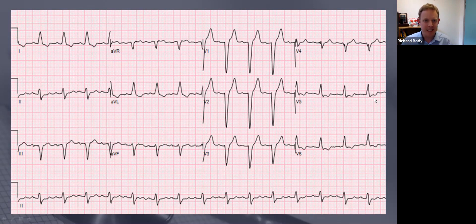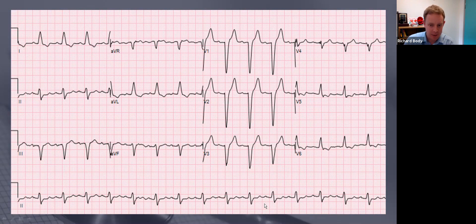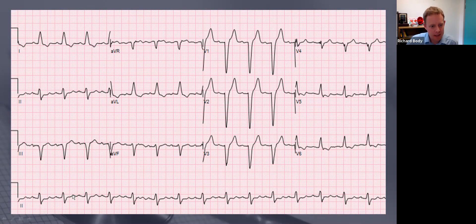Welcome to the first ECG in a minute podcast, where I'm going to try and go through an ECG in a minute. Here's our first ECG - you can see it's a 12-lead, and on this rhythm strip we can see we've got sinus rhythm.